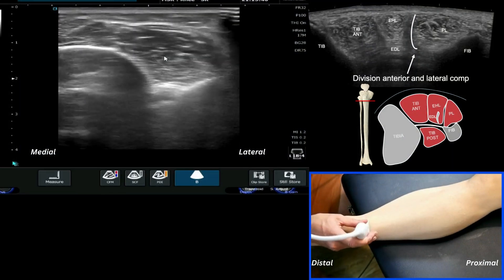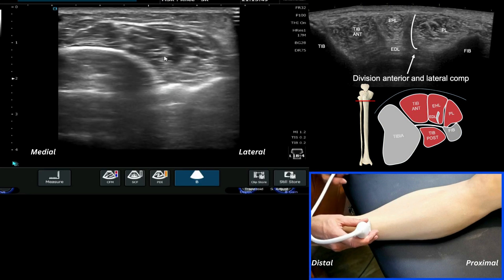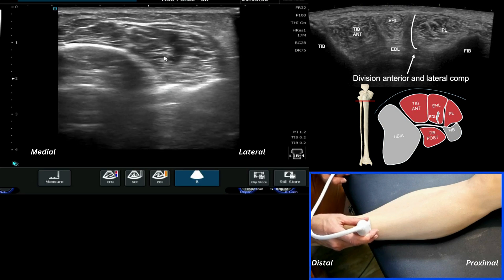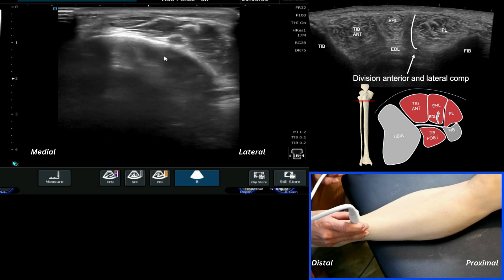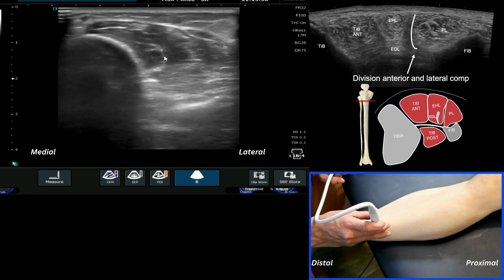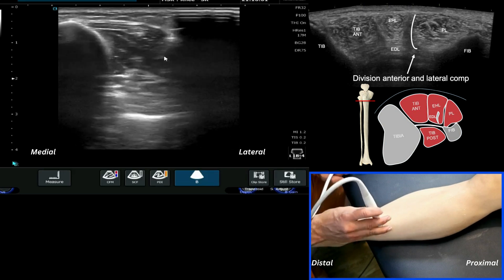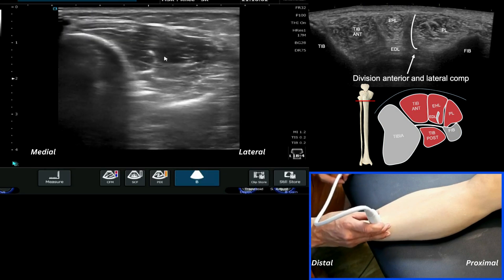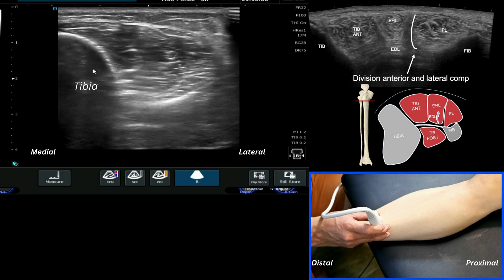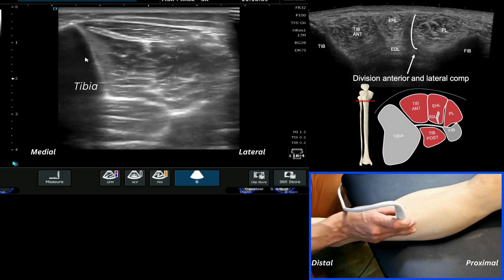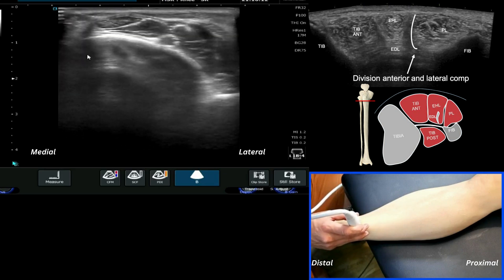This video looks at the anterior compartment of the lower leg. We're going to use our skeletal landmarks to help identify where we are. Starting with the most medial aspect, we can see with the cursor the very clear outline of a large bone, which is your tibia.